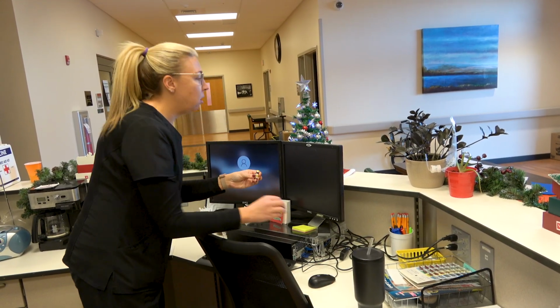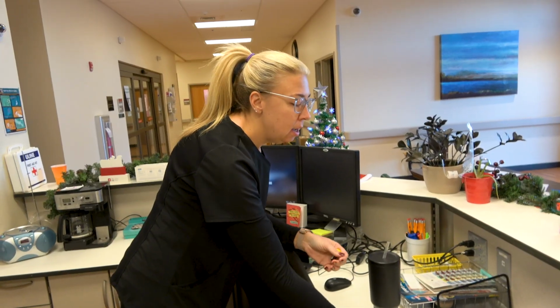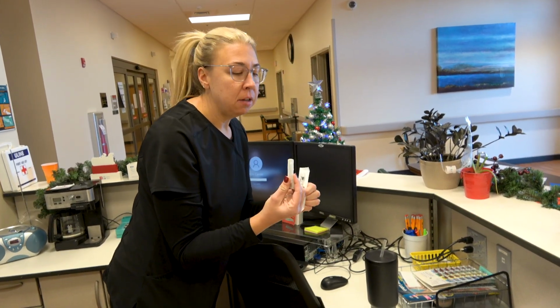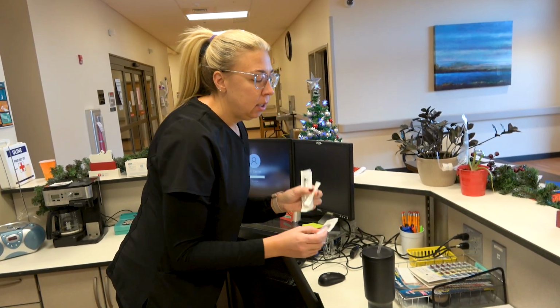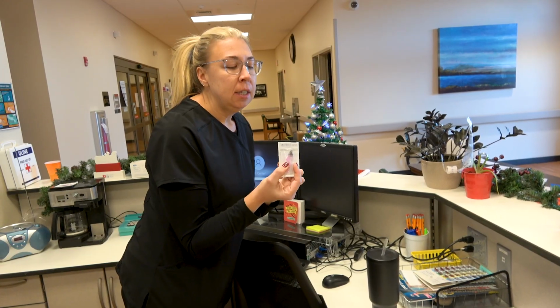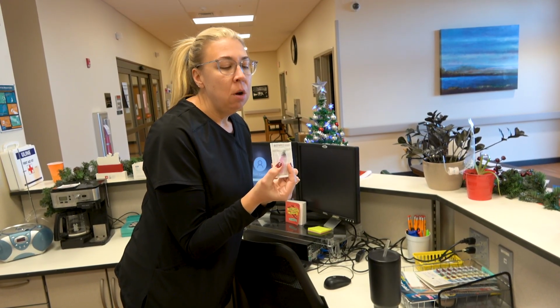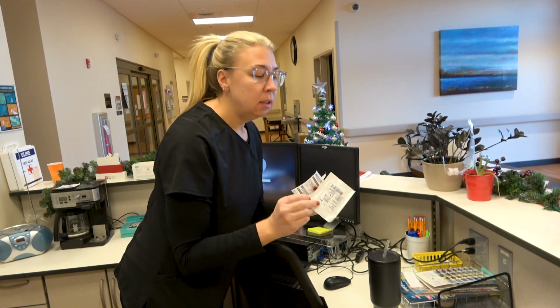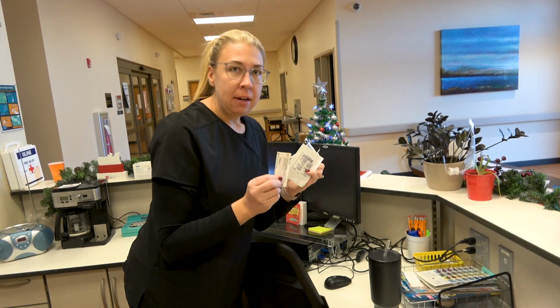And now I'm going to go ahead and gather my supplies. I am going to need a syringe, a needleless cannula to draw it up. I'm going to switch that needleless cannula out to a needle. For IM injections, it's 22 to 25 gauge, 1 to 1.5 inch. I need a piece of gauze, and I also need a Band-Aid.